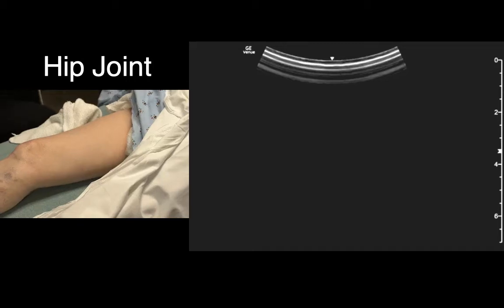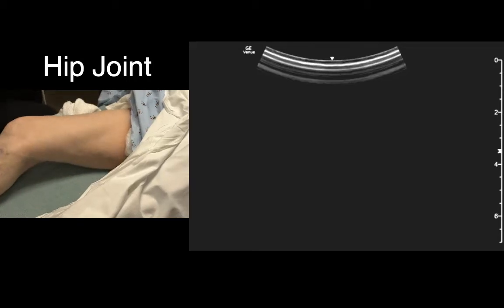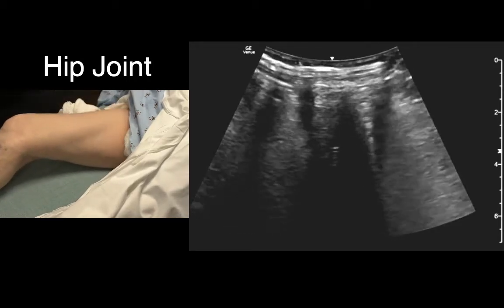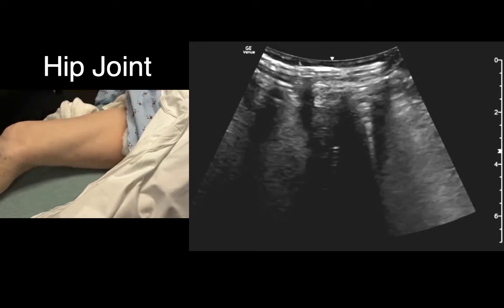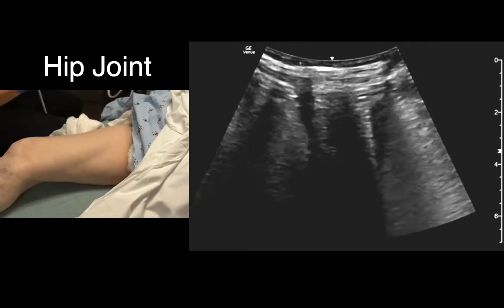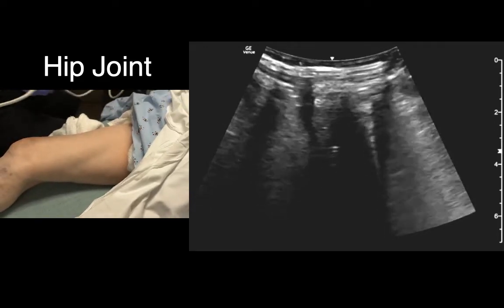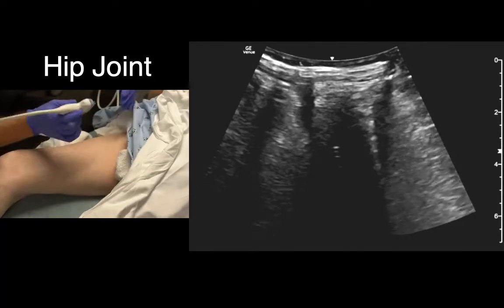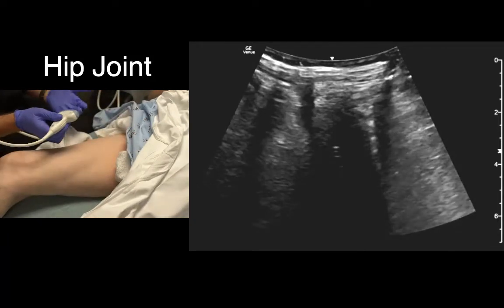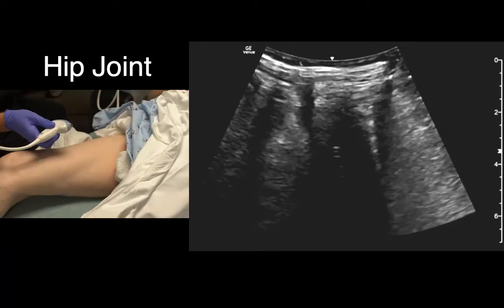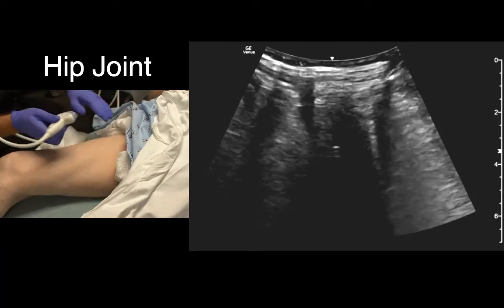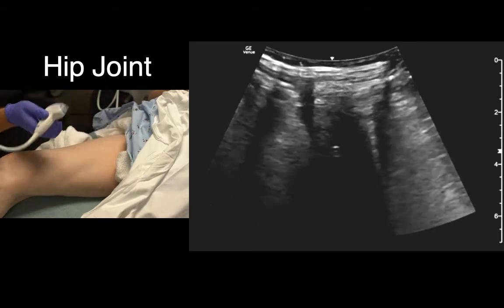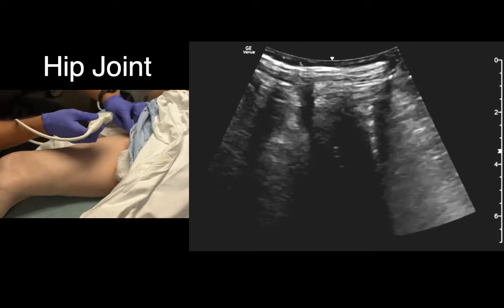The first structure we're going to look at in the lower extremity is the hip joint. This is very PEDS relevant. If it's a little kid, we could probably use the linear probe. In adults or bigger kids, we often use the curve because it gives us a wider view of the whole joint space.